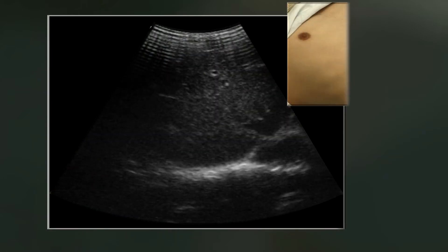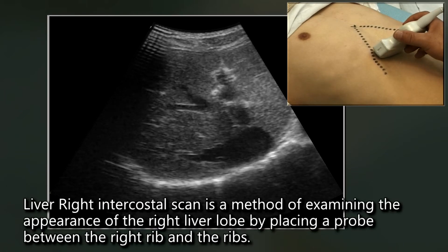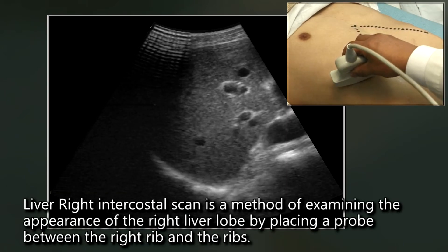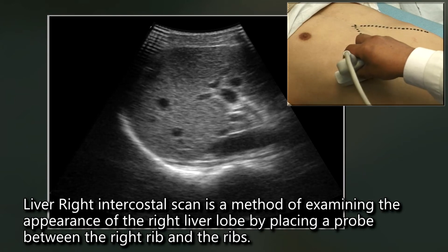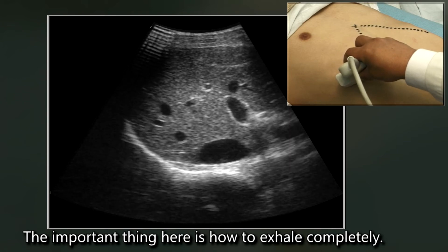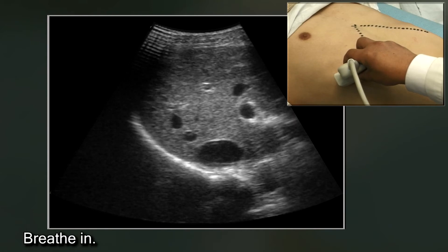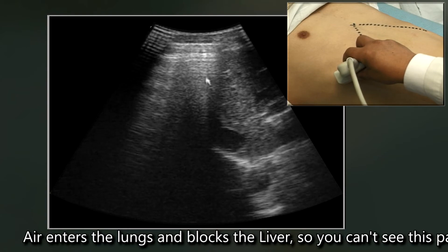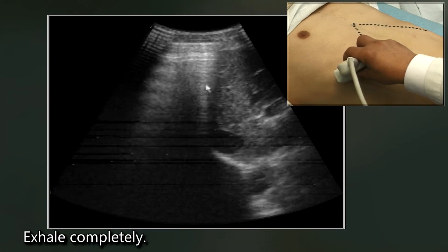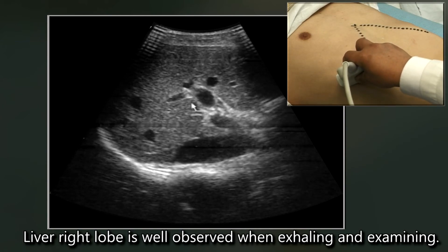Let's practice based on what we have learned. The liver right intercostal scan is a method of examining the right liver lobe by placing a probe between the right ribs. The key point is to exhale completely. When you breathe in, air enters the lungs and blocks the liver. When you exhale completely, the right liver lobe is well observed.